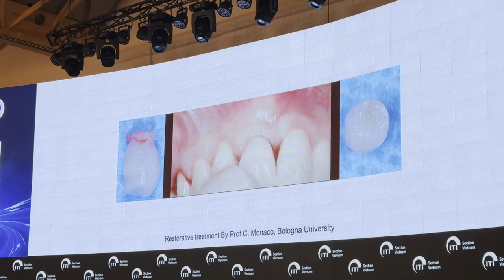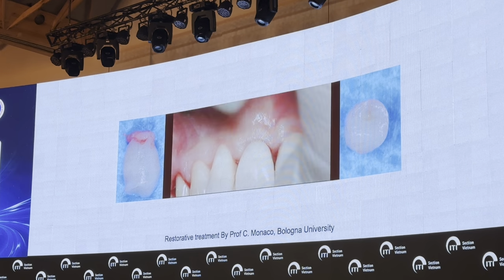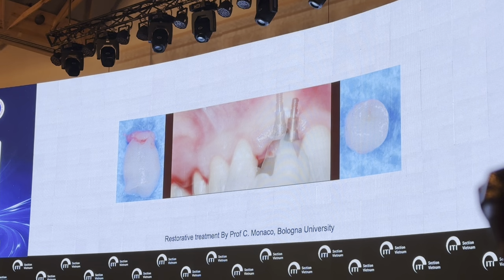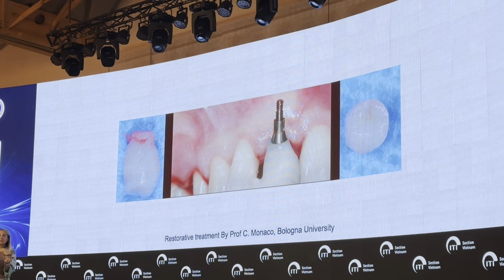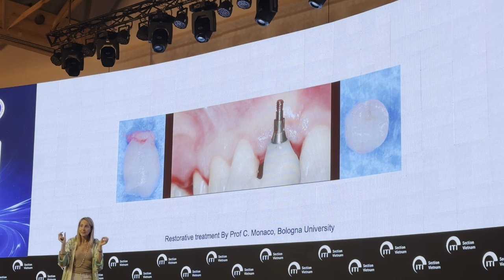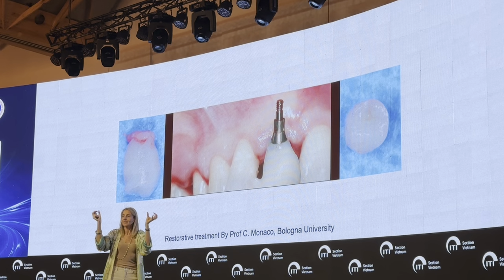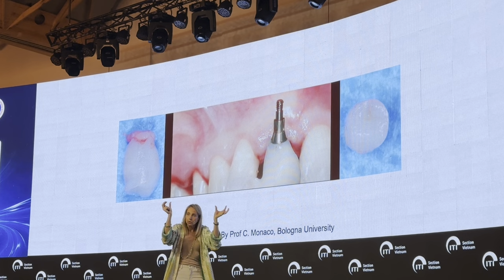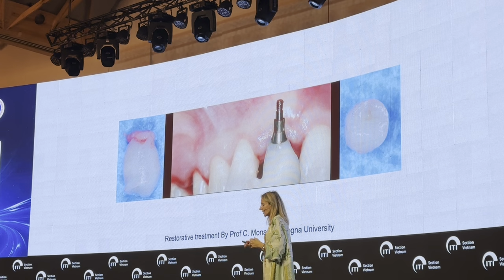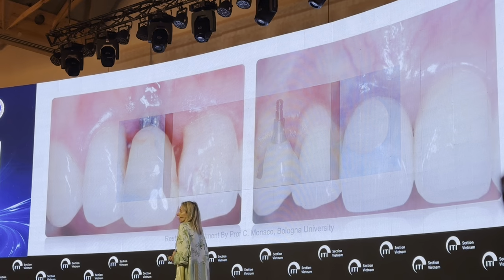And we can place the provisional crown to start the conditioning phase because we have now a flat edentulous area, so we need to push in an apical direction the soft tissue margin, and at the same time, with the conditioning phase, guide the regrowth toward the coronal aspect to fulfill the interproximal space of the interproximal soft tissue.